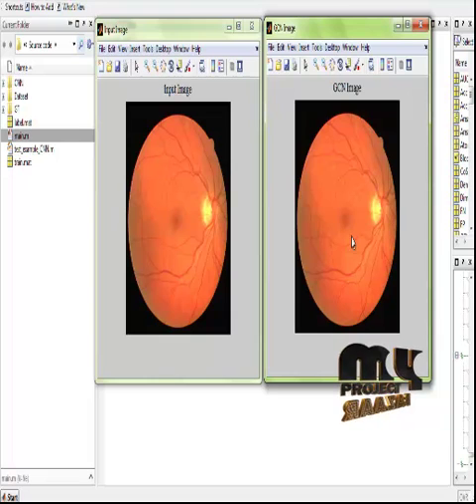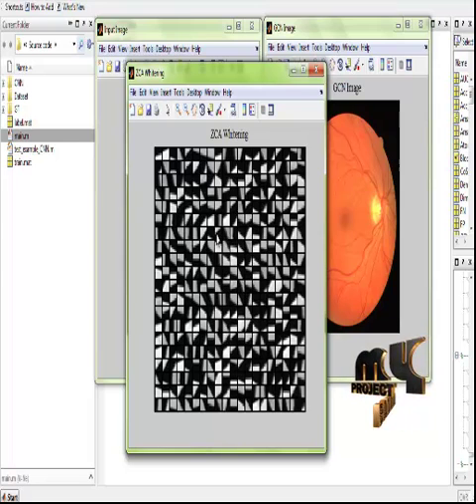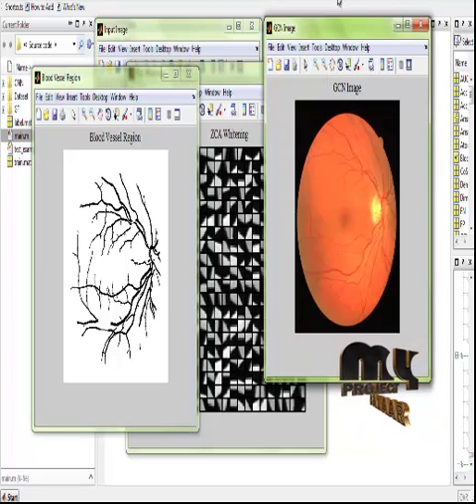This image is obtained after the global contrast normalization of the input image. As we can see, these two images are visually similar, but the contrast of the overall image is normalized. The next step is the zero phase component analysis. In this process, the image patches are differentiated and matched in order to identify the exact portions of the retinal images. The patches of the input images are separated in randomized order and the whitening process is applied.